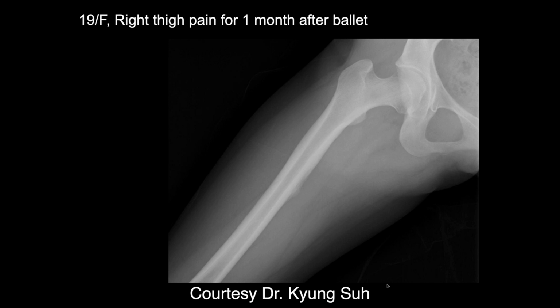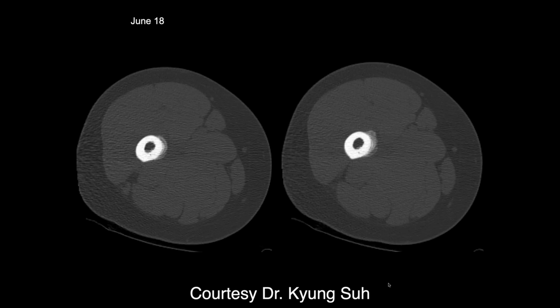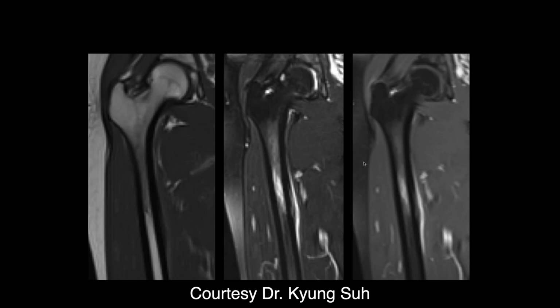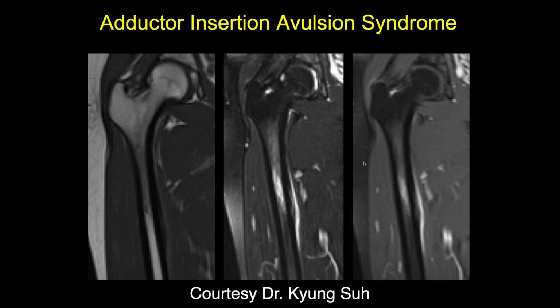Ashley, what do you think of this case? 19-year-old female with right thigh pain for 1 month after ballet. Along the medial aspect of the proximal femoral diaphysis, you see some periosteal reaction. It's a little bit irregular. I'd like to get an MRI to confirm that. On CT, you can again see some periosteal reaction and possible tug lesion there, with increased edema on the MRI STIR sequences at the adductor, and a lot of stress reaction in the bone. So again, adductor insertion avulsion syndrome.